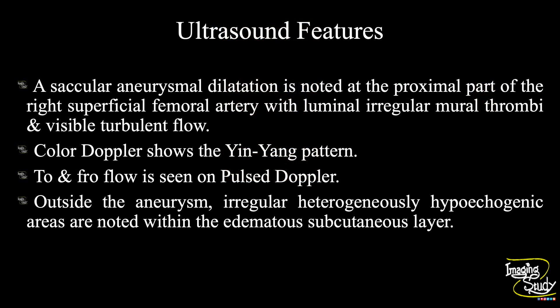In summary, a saccular aneurysmal dilatation is noted at the proximal part of the superficial femoral artery with luminal irregular mural thrombi and visible turbulent flow on color Doppler. A yin-yang pattern is noted; to-and-fro flow is seen on pulse Doppler. Irregular heterogeneously hypoechoic areas are noted within the edematous subcutaneous layer adjacent to this saccular aneurysm, indicating hematoma.